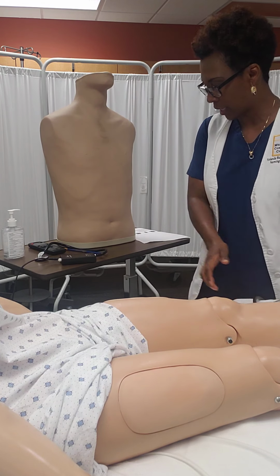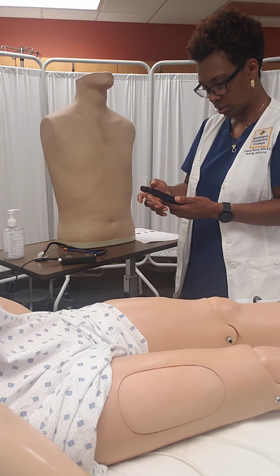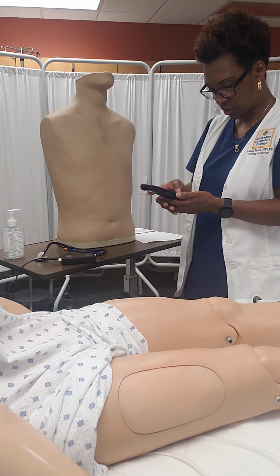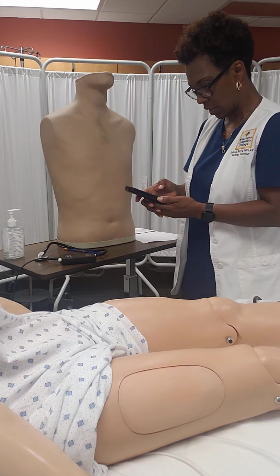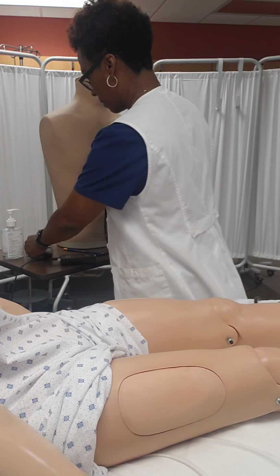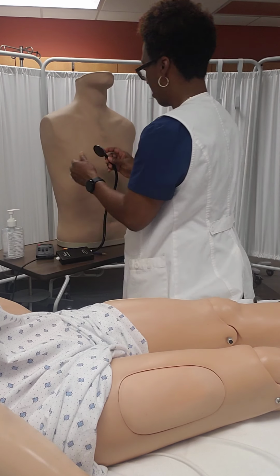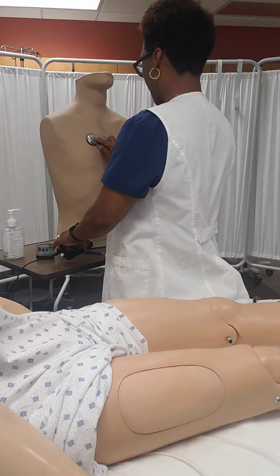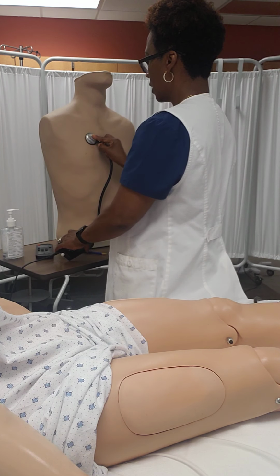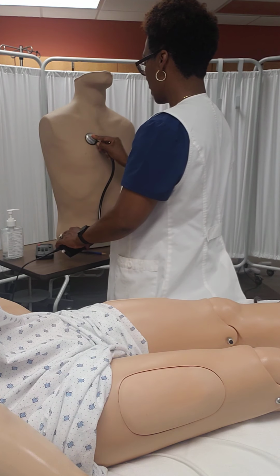Actually, let's see, I think I have this here. I am going to turn it on. Heart. Let's see if you can hear it, okay? Turn it up a little bit. Okay, so that's your aortic at the second intercostal space.